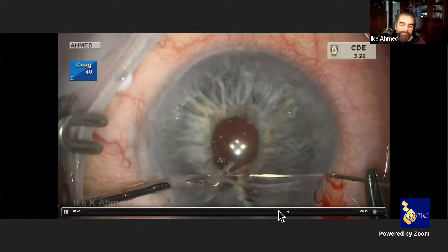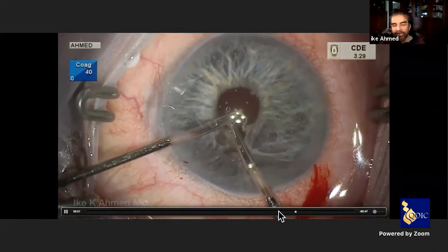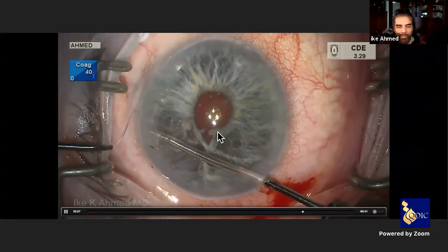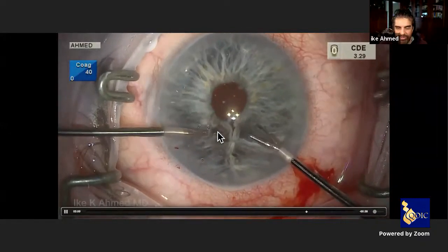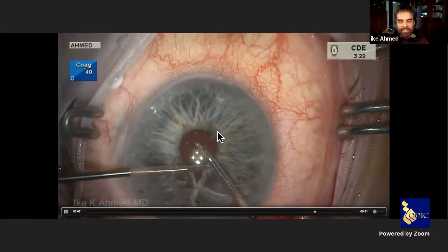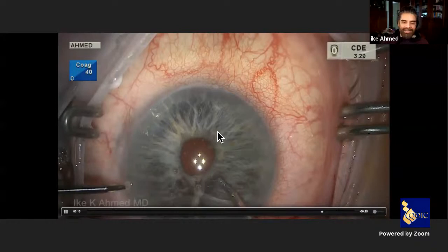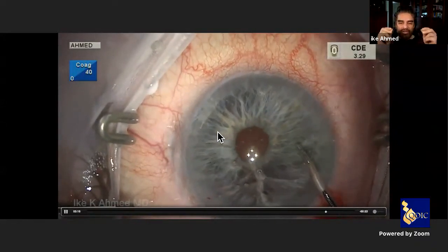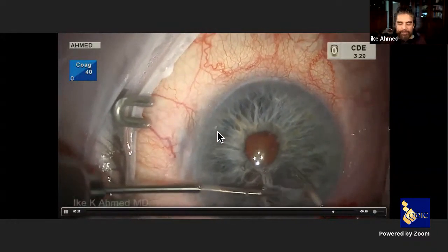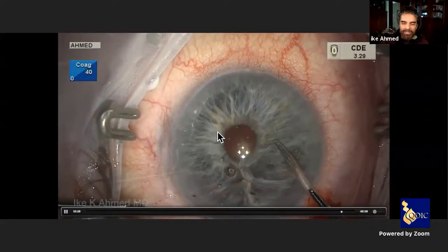One of the most important aspects of a normal-looking eye to our patients is a round, centrally positioned pupil. We take great effort to achieve this, requiring a critical eye to visualize where the iris tissue will come together. The intraocular tying technique uses two micro-tiers in the eye — teaching surgeons the importance of using incisions as a fulcrum and letting fingertip movement do the work, avoiding excessive pushing or pulling on the eye. This is the true art of microsurgery.